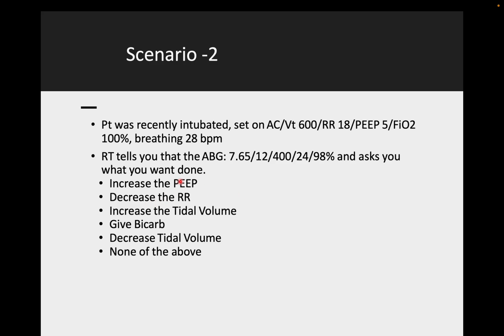So why not decrease the respiratory rate? I tell you again, if you decrease the respiratory rate, the spontaneous breaths are anyways there, so you will obviously hyperventilate. There is no point in decreasing the respiratory rate, and anyways in assist control ventilation, they will all be supported. So it is better to sedate the patient and decrease the spontaneous breaths themselves, so that it will decrease the excessive tachypnea and excessive minute ventilation, and the respiratory alkalosis will be corrected. This is a common complication in assist control ventilation.